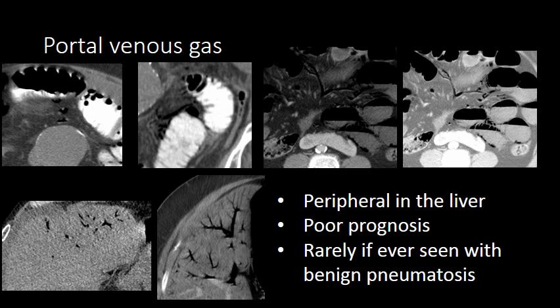When trying to detect portal venous gas or mesenteric venous gas, lung windows will help you see the gas more clearly. Portal venous gas is more peripheral in the liver than the gas associated with pneumobilia, and it is rarely, if ever, seen with benign pneumatosis. Here are multiple examples where you can see gas tracking within the mesenteric veins, outlining the veins, with increased conspicuity when placed on lung windows.